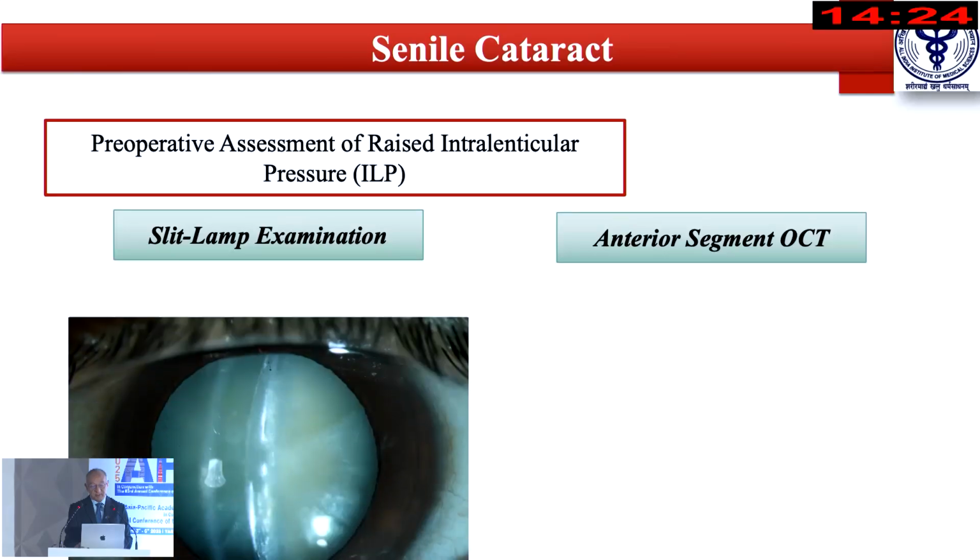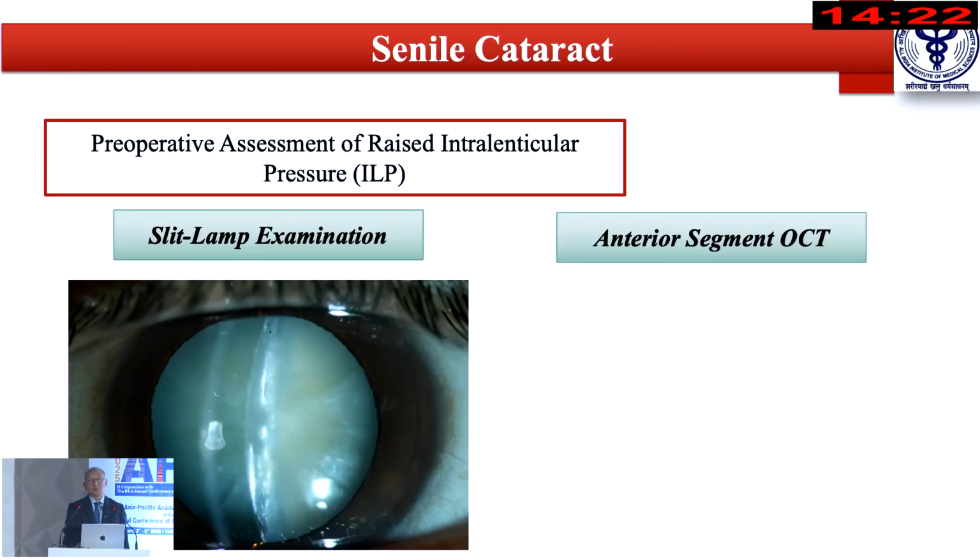Also to enhance your safety, and also look into the eye. When you're doing surgery, what are the various dynamics which can happen, which can change your concept of visualization during surgery? It is so important in these cases also. This is what we have been doing regularly.